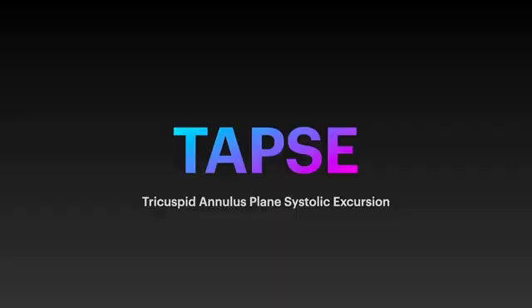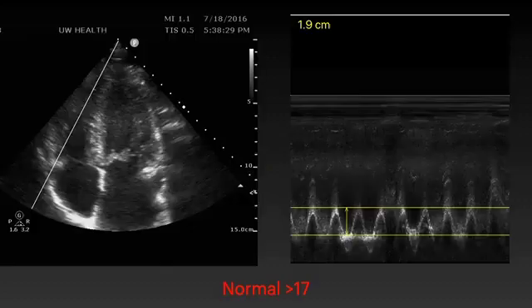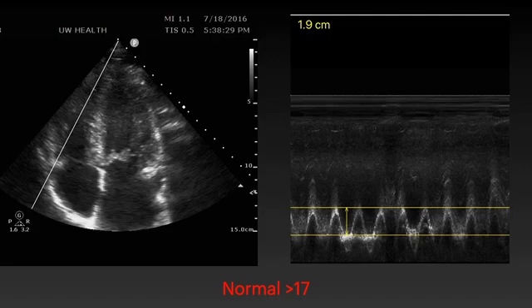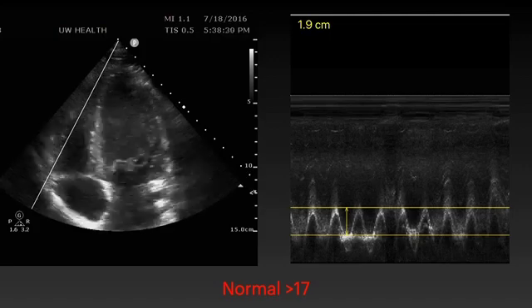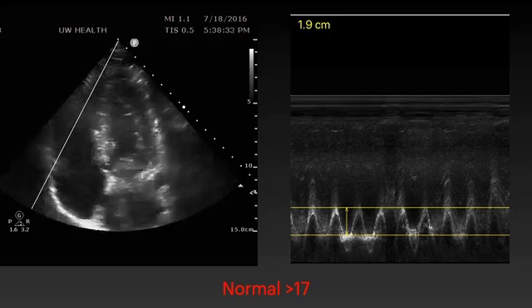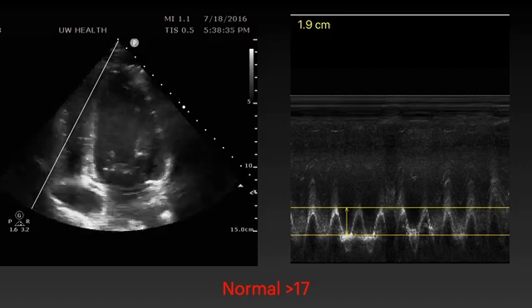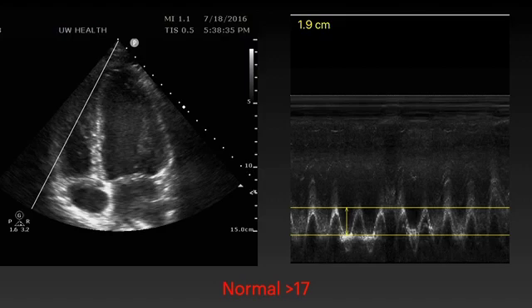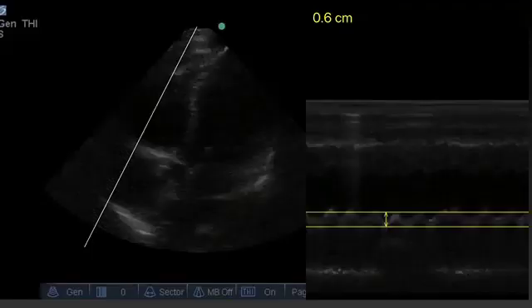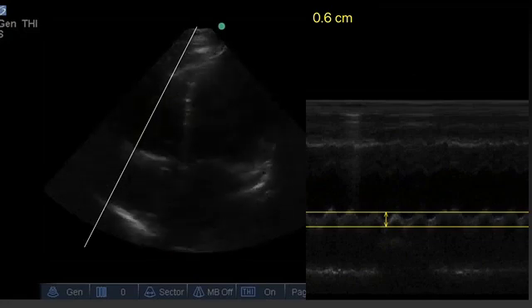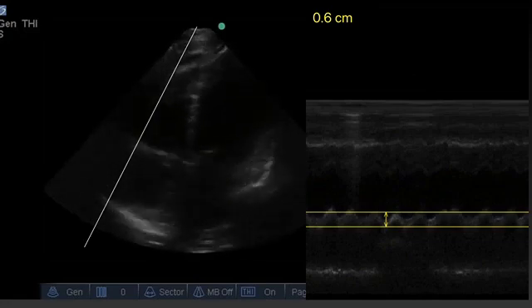You can quantitatively measure RV function by the TAPSE, which is the tricuspid annular plane systolic excursion. It's measuring basically how much the tricuspid valve annulus is moving as well as the right ventricular free wall. In the apical four-chamber view, put the M-mode gate down through where the RV wall meets the tricuspid valve and you'll see a series of humps — this is the movement of the free wall and the valve. You measure how tall this is and that's the TAPSE. You want it to be more than 17, as TAPSE less than 17 correlates with poor RV function, like this echo shows.